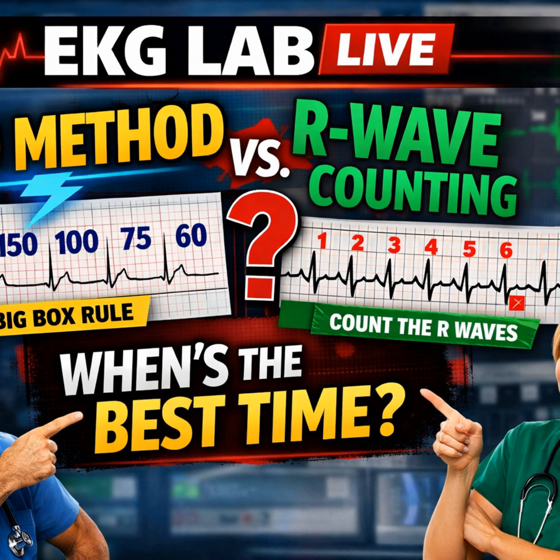While we've covered a significant amount of ground here, we've gone from the mechanics of the grid to the psychology of the emergency room. It's clear this isn't just about counting numbers. So let's summarize where we stand. My position remains that the big box method, that 300, 150, 100 sequence, is the tool of the expert diagnostician. It's essential for regular rhythms like SVT and atrial flutter, where specific rate cutoffs really define the pathology. It aligns with that analytical reasoning we need to overcome bias, and it respects the EKG as a calibrated instrument.